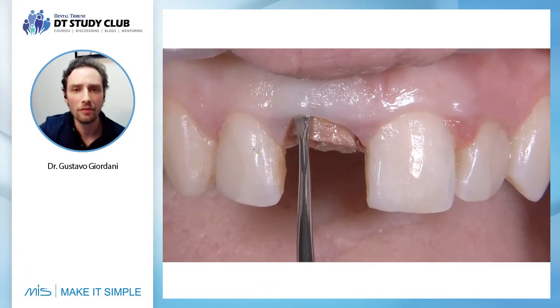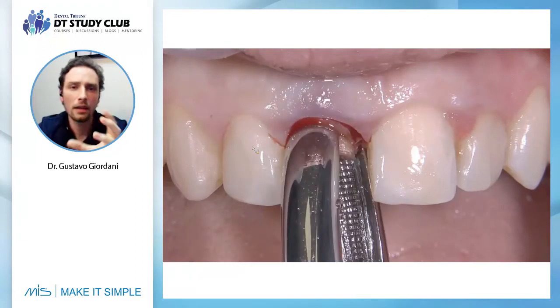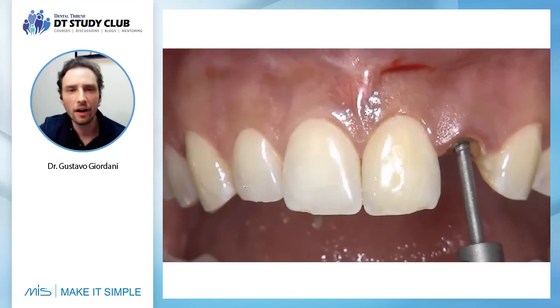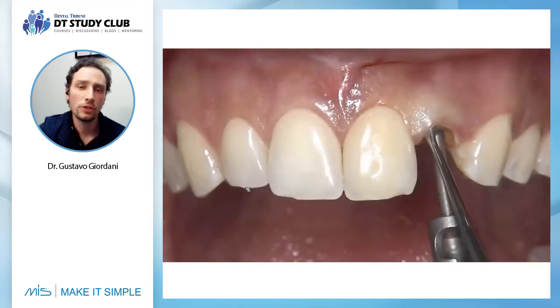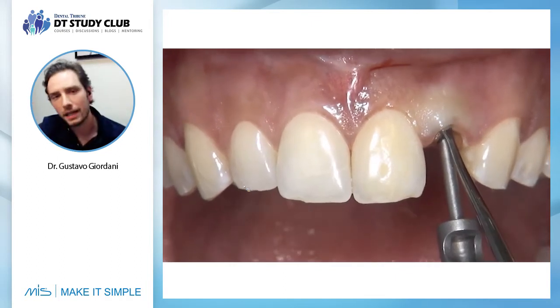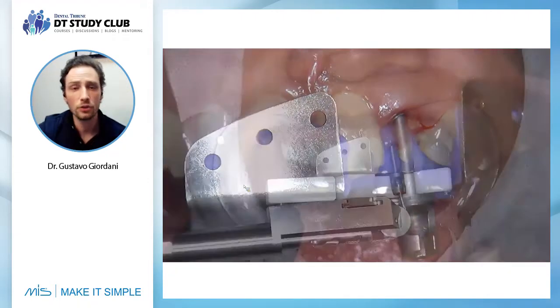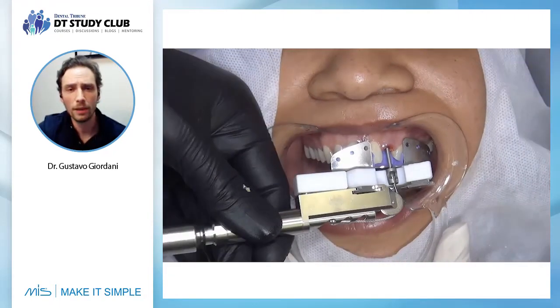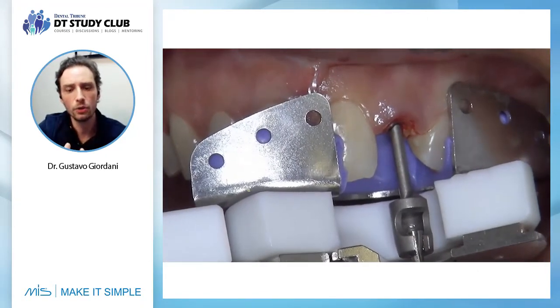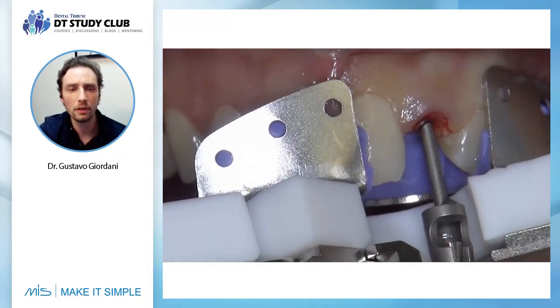Sometimes we don't have a very good tooth to take and do these round movements with your forceps. So there are many devices in the market to extract the tooth in a very gentle way. So we can use a Benex device, or a similar device, to extract this tooth in a very gentle way. Because when you don't have enough room to take your root with the forceps, it's really not easy to extract a tooth in a minimal invasive way.